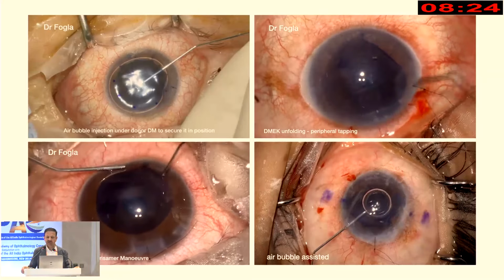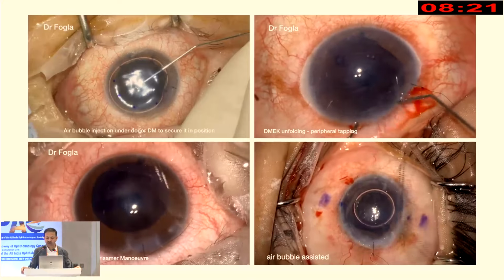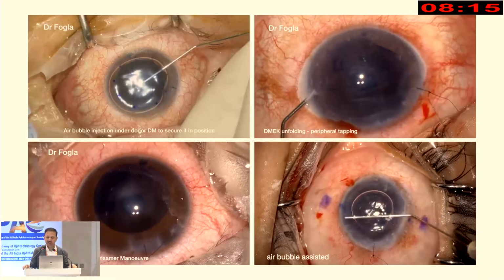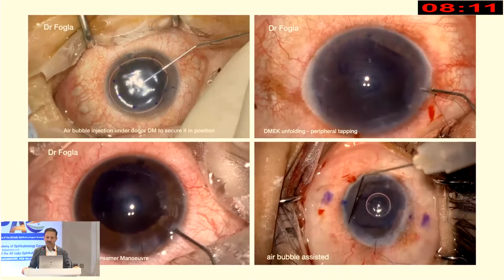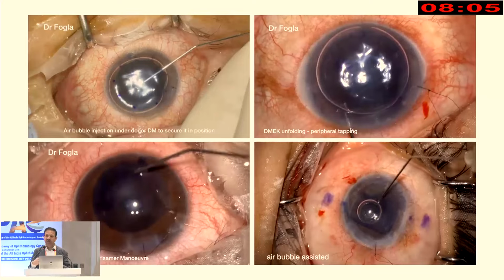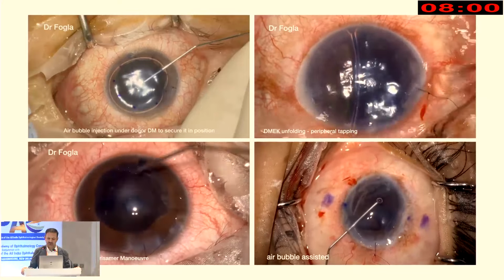If you have a vitrectomized eye, an eye with a deep anterior chamber, or a high myopic eye, you can use an air bubble on top of the scroll. That means within the scroll you can put a small air bubble and then use that air bubble to manipulate the scroll to open up. But remember, once the scroll is open, you remove that air bubble very gradually, because if you remove it quickly, again the scroll will go to its original position.